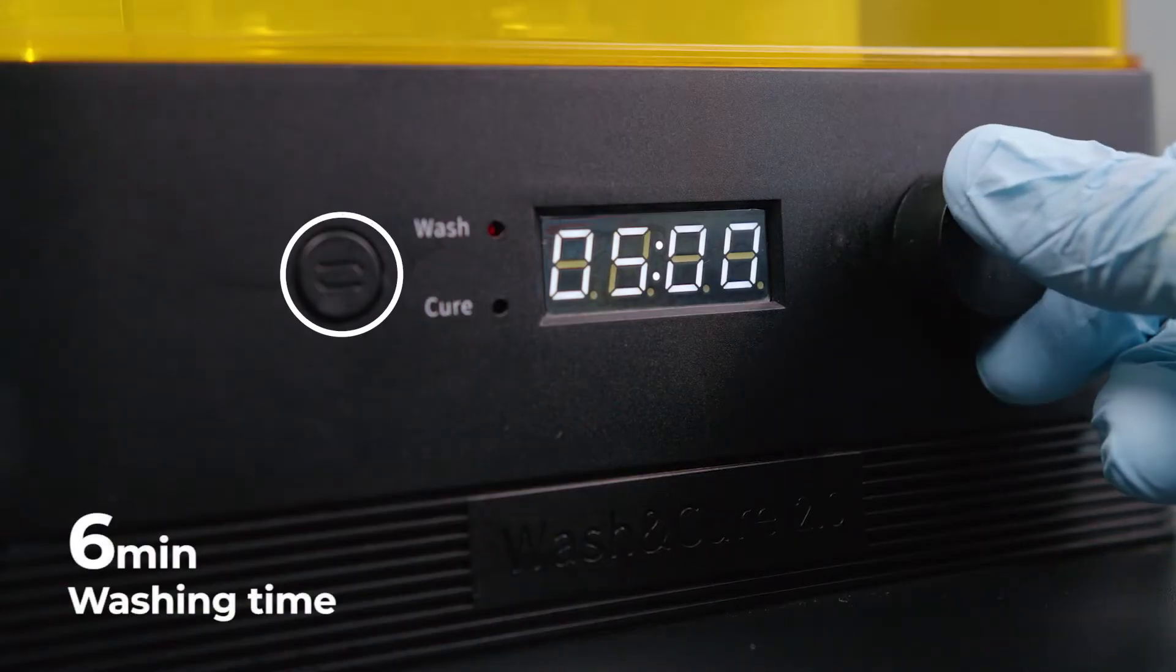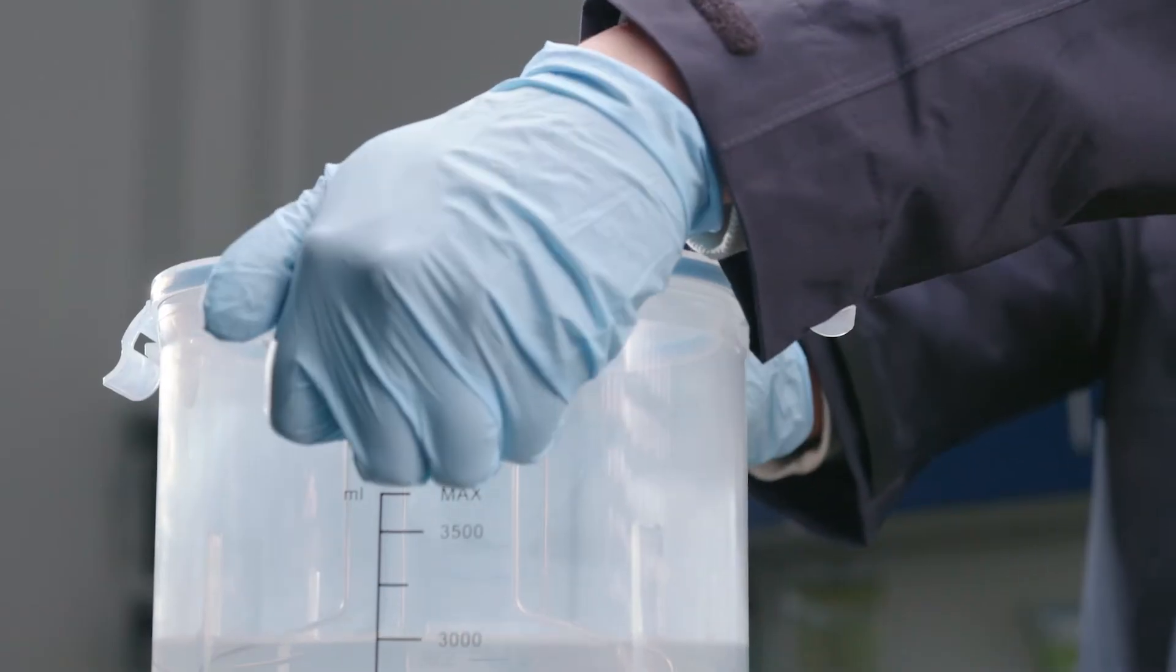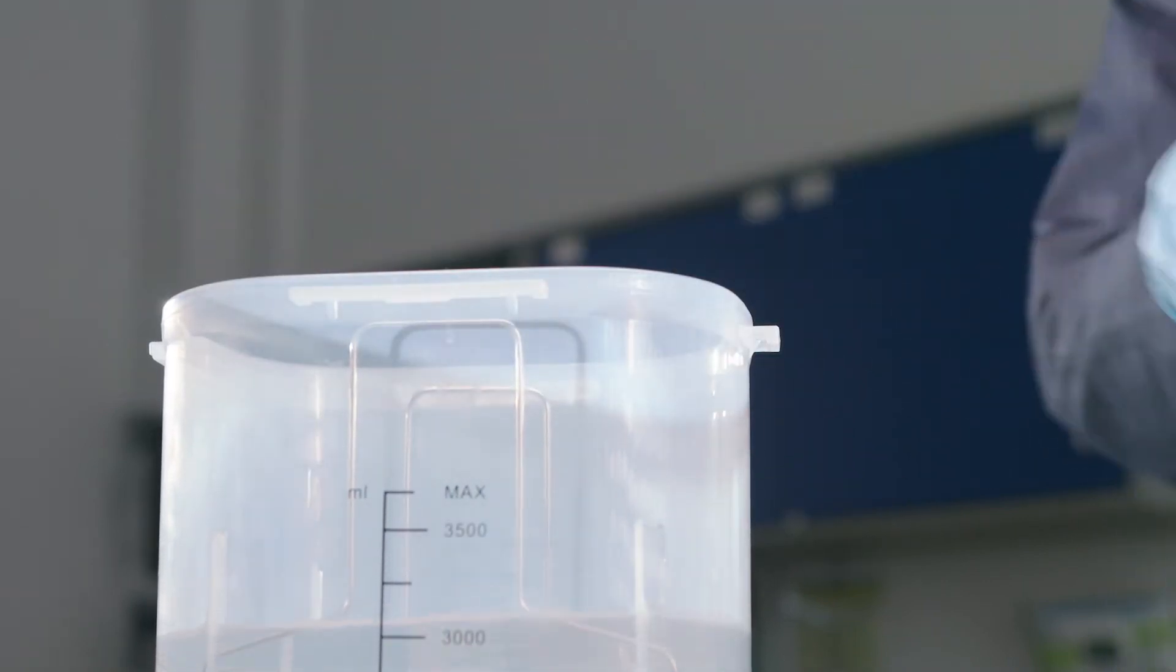The container is inserted in the finishing station. This station is closed with the lid. The button on the front of the printer must first be set to wash. The time can be set to 6 minutes with the rotary control. The wash process can be started.